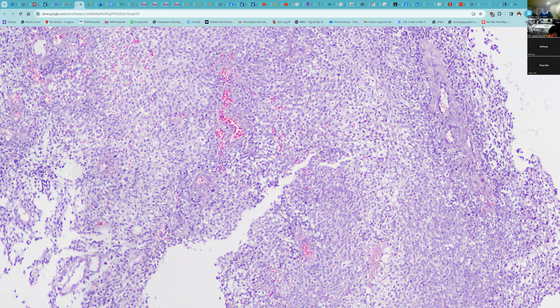And then there are a couple of things that might present, since this is just a biopsy and there might be other morphologies. So sometimes there's a sinonasal carcinosarcoma or sarcomatoid lesion that can have different morphologies in different areas. So it's a more pleomorphic, polymorphous appearance with some very bad areas like this. And other times there'll be a more sarcomatous or different appearance.